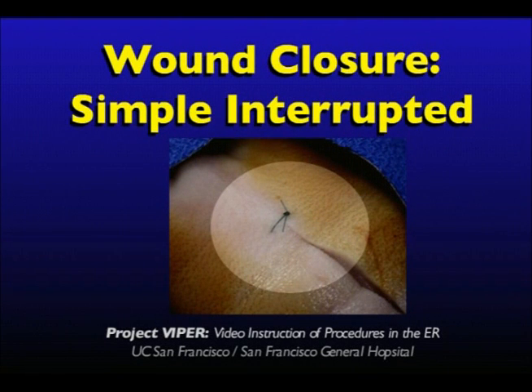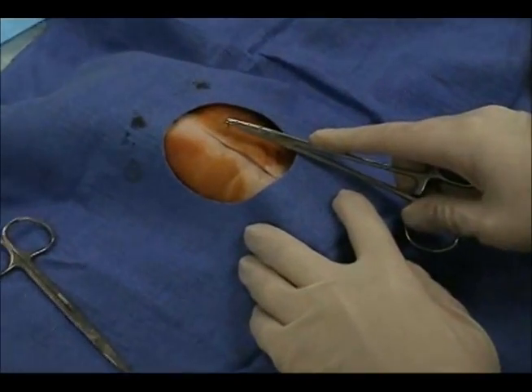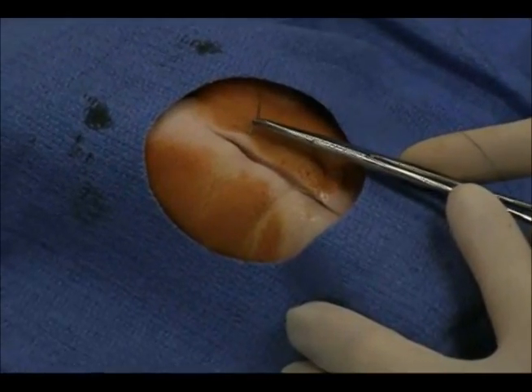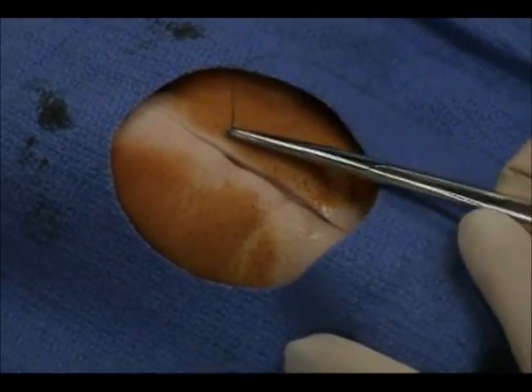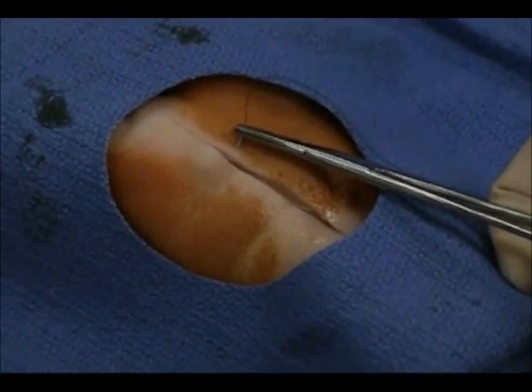Wound Closure: Simple Interrupted. The Simple Interrupted Suture is by far the most common suturing technique used in the emergency department and urgent care settings. Insert the needle into the skin at a 90 degree angle. Using your wrist and the needle curvature, penetrate the dermis and advance the needle through to the opposite side of the wound.